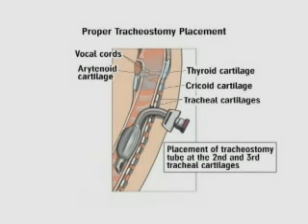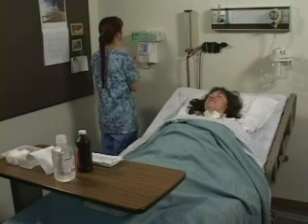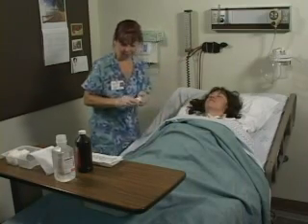A client with a tracheostomy has secretions that collect through the tracheostomy tube and require suctioning. These secretions can also cough around the tube such that the skin and tube require special care. Because the tracheostomy tube is holding open the airway, special care must be taken that the tube is not dislodged during the cleaning process. As before any procedure, wash your hands and wear gloves. The soiled dressing is removed by gently loosening it from around the neck plate. Inspect it for color and odor of drainage.